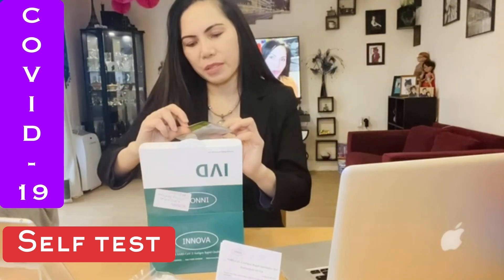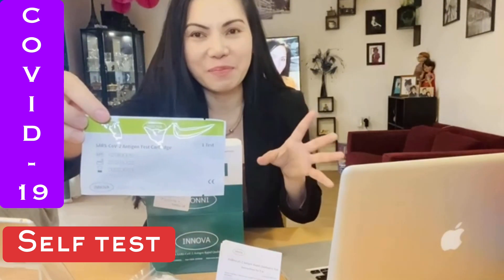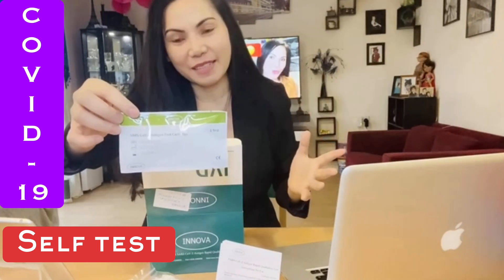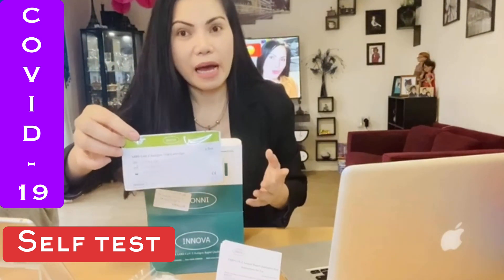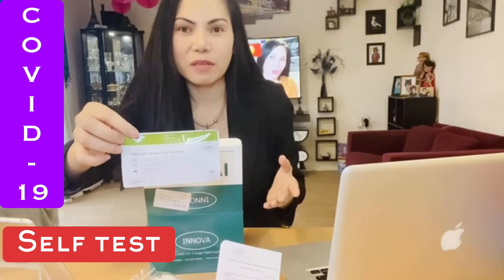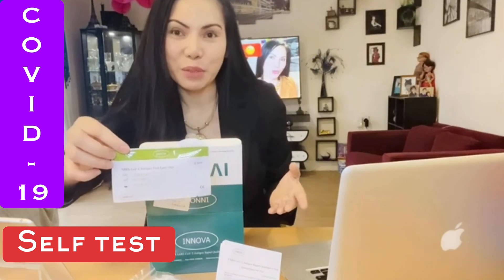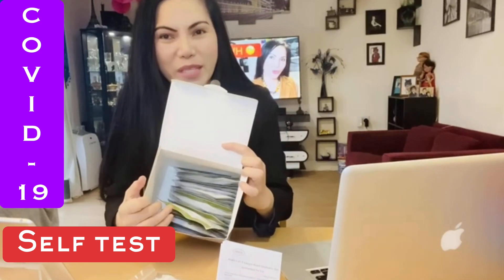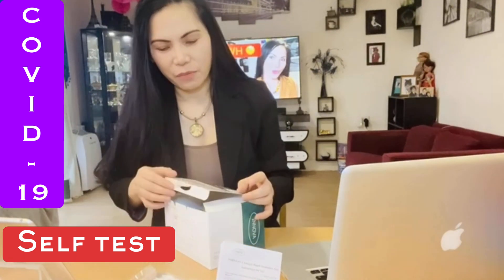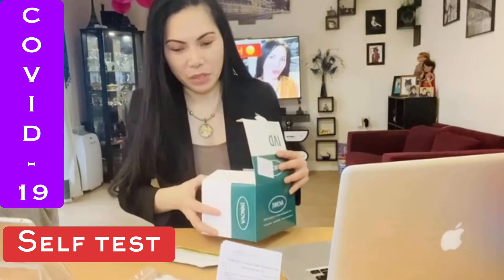We have the instruction leaflet explaining how to do the antigen rapid quality test. And of course we have the actual test cartridge — just like when you do a pregnancy test or a drug test. Even though you don't have any symptoms, you still have to do the test; this is to detect early. We have about 20 to 25 pieces here, enough for quite a few weeks.